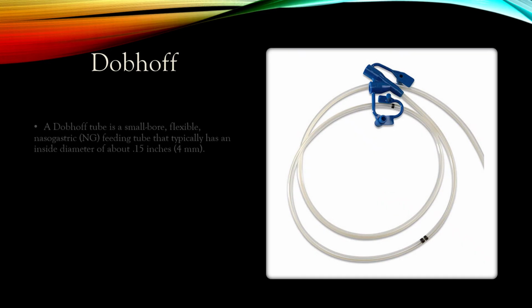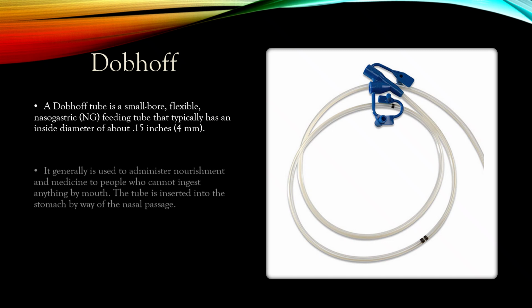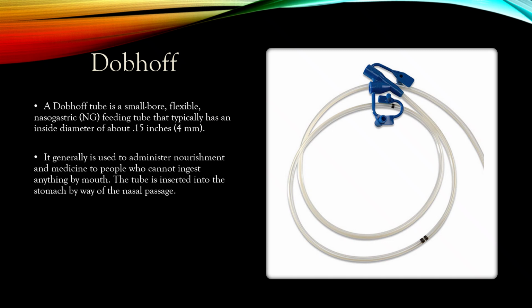Dobhoff. A Dobhoff tube is a small bore, flexible nasogastric NG feeding tube that typically has an inside diameter of about 0.15 inches or 4 millimeters. It is generally used to administer nourishment and medicine to people who cannot ingest anything by mouth. The tube is inserted into the stomach by way of the nasal passage. Correct placement in the body usually is checked by an X-ray.